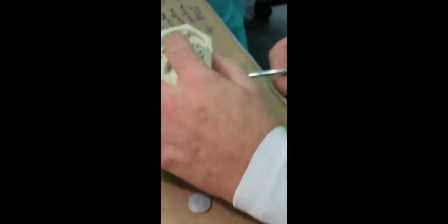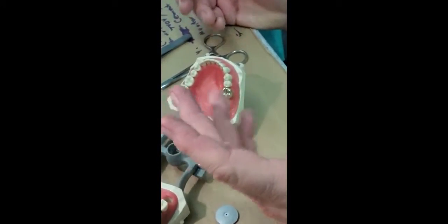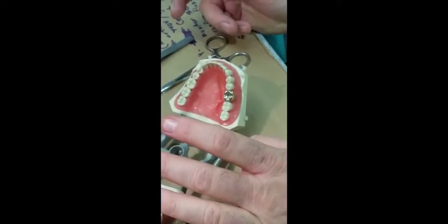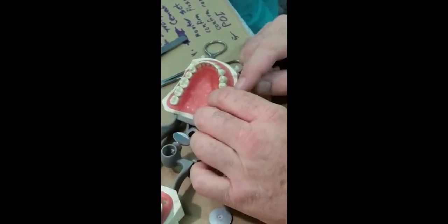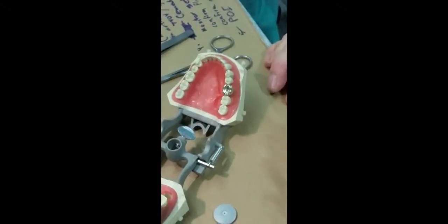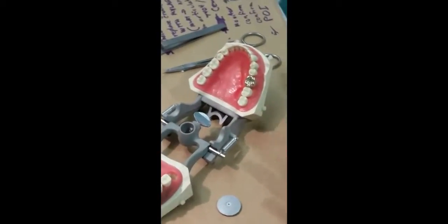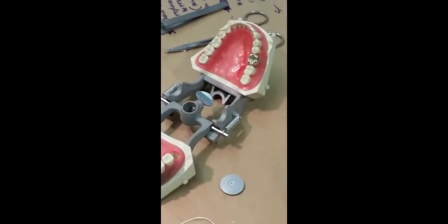On 29 it's open. Have the patient bite harder — it's not holding. Bite harder — it's finally holding. So it's very close. Your clinical solution would be to ask: 'How does it feel? Does it feel a little high?' The tooth is going to be a little sensitive; they're used to the temporary. It's not a perfect solution, and some patients just don't know. But if you think it could be high, you generally want to adjust.